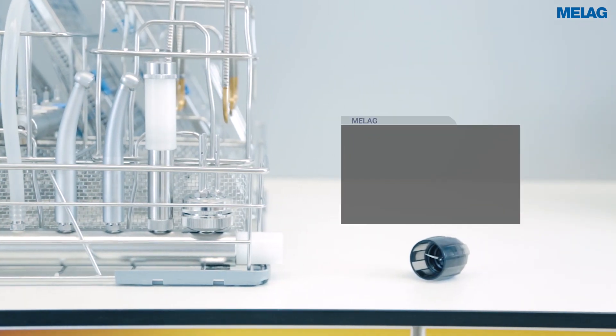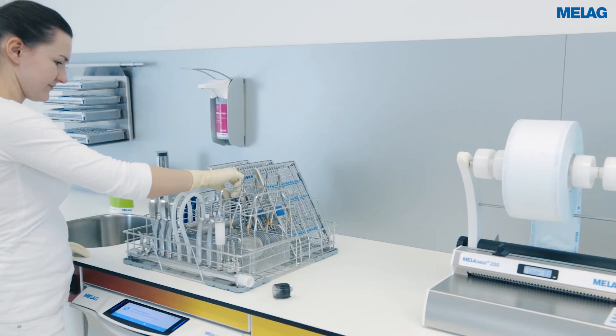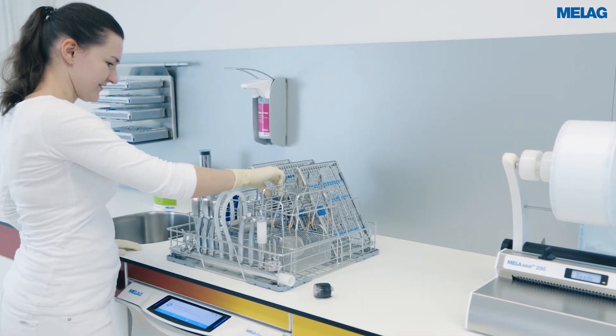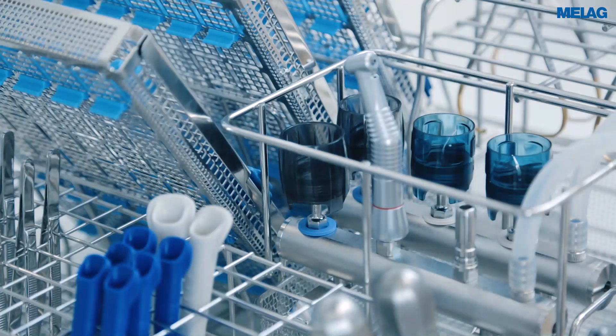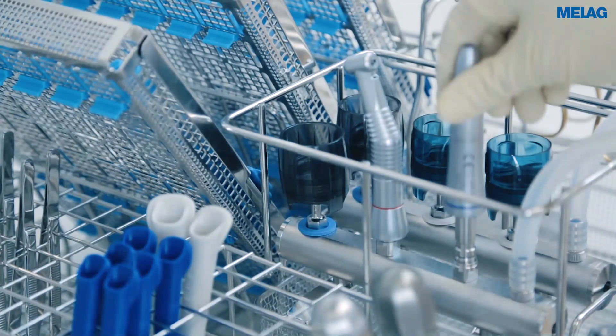You can connect ultrasonic scaler tips safely using the torque wrench. The injector basket Flex 1 provides a space-saving solution for the decontamination of ultrasonic scaler tips and further handpieces.